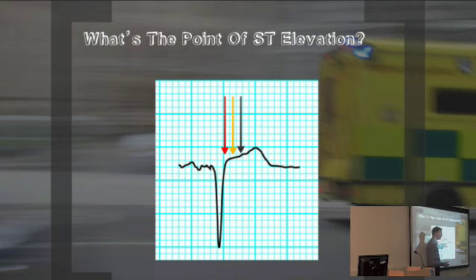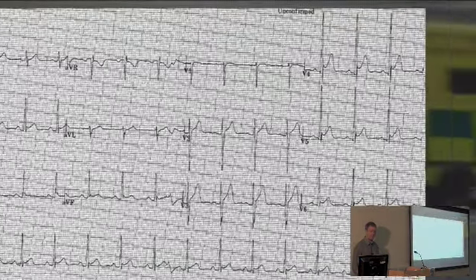But what I would rely on more, this is a practical point for your practice, is pattern recognition. I wouldn't get so hung up on which point exactly you measure it. It's looking at the pattern, seeing so many ECGs, that you recognise that the shape of that ST elevation is definitely an MI and not high take-off. That's much more important than actually counting, and I think that's something that you'll come across a lot.